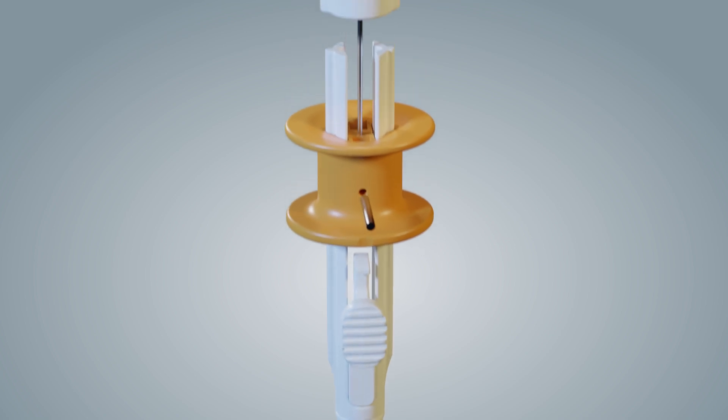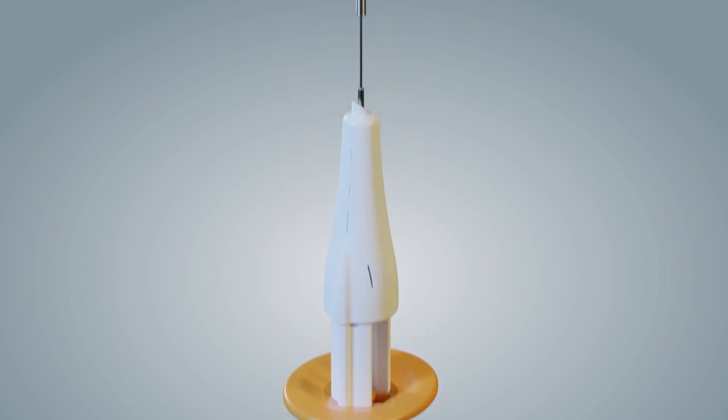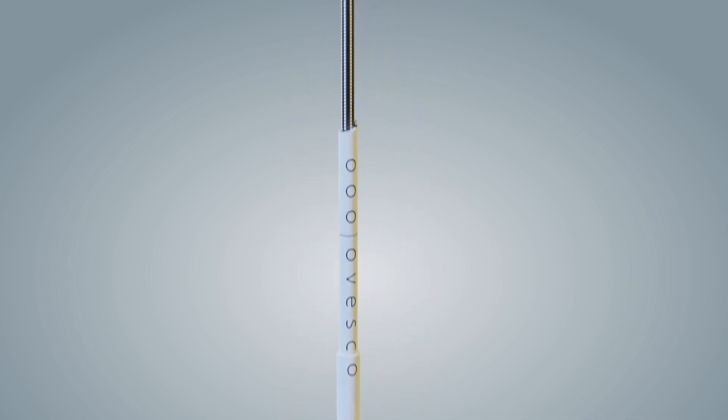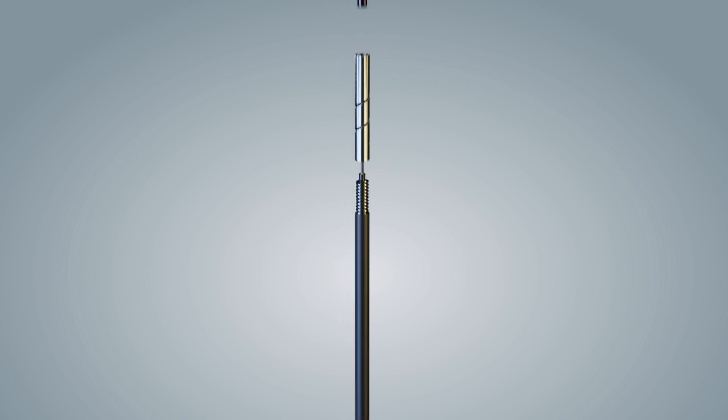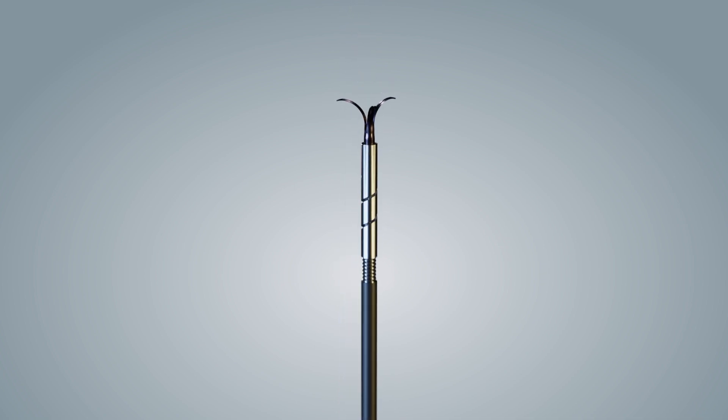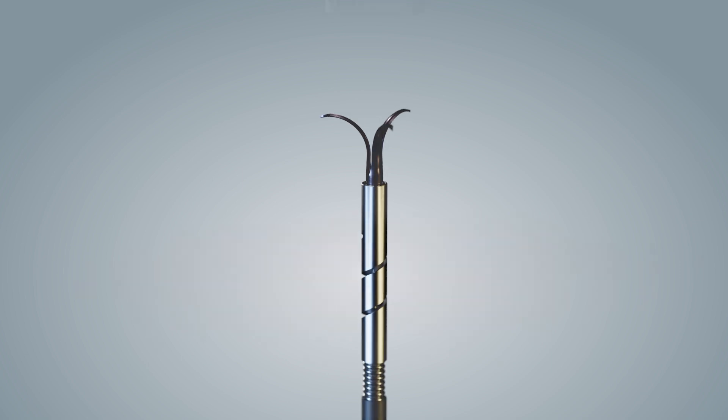For fibrotic or hard tissue, the OTSC anchor can be helpful to precisely align the targeted tissue to the cap opening and hold it in place during clip application. The anchor can be used with a cap depth of either 3 or 6 millimeters.